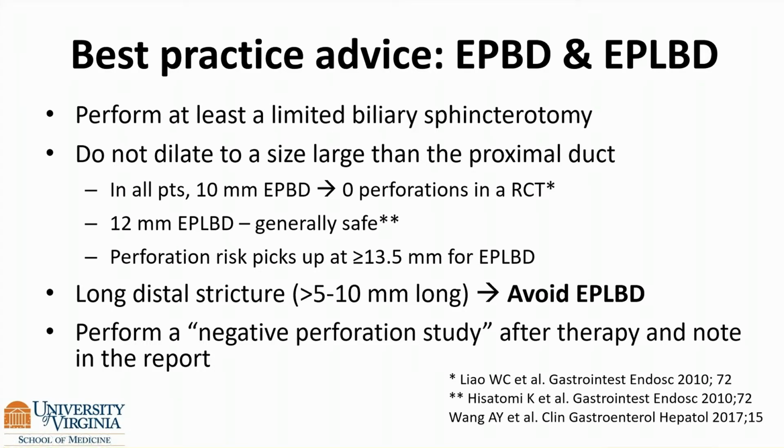Now, after most therapeutic ERCP maneuvers, I think it's reasonable to perform what some call a negative perforation study. Really either sweep through with contrast or just watch contrast drain from the duct, and note it in your note. This is an important step to make sure you haven't injured the duct and caused extravasation. It can also be important medically.